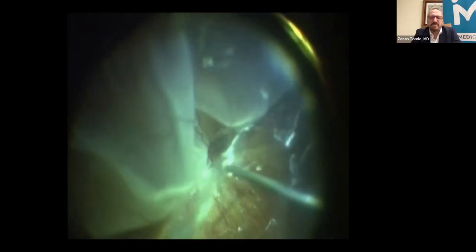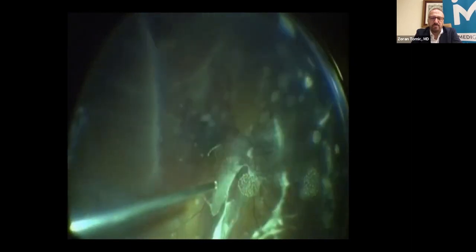For other cases, no. There is usually, in most of the cases, PVD, which is already present, but not in children and not in high myopic patients. In high myopic patients or myopic patients, there is a risk for vitreoschisis. And then you see the removal of the inferior part of the hyaloid, but you are not allowed to be satisfied with this one. You have to look for all the remnants of the PVD. The worst thing is to put the gas or silicone oil over it, because then you will get immediately PVR and all the repeated surgeries.